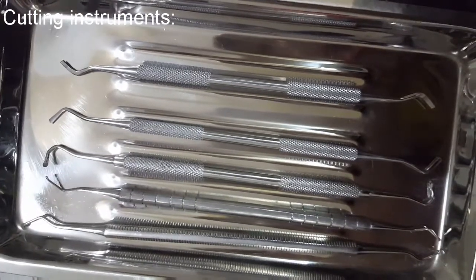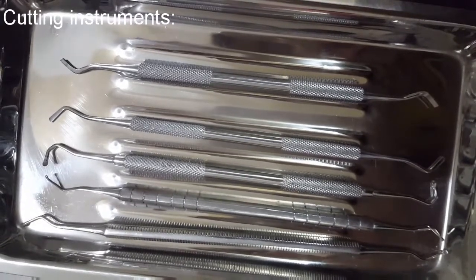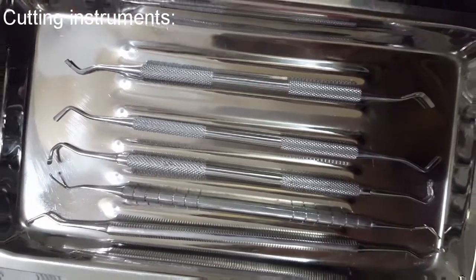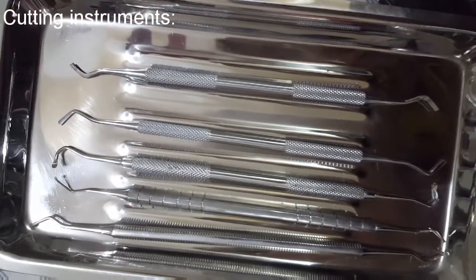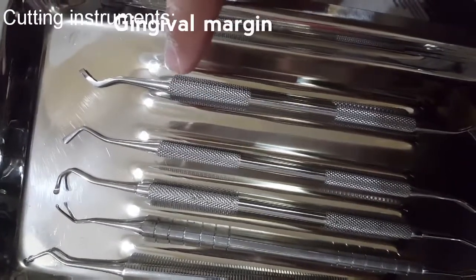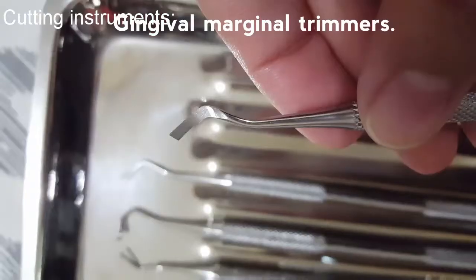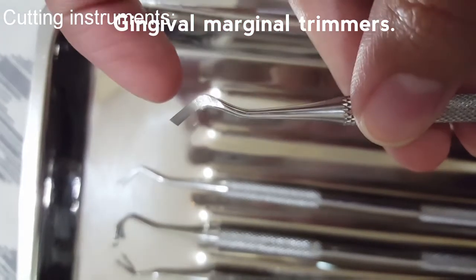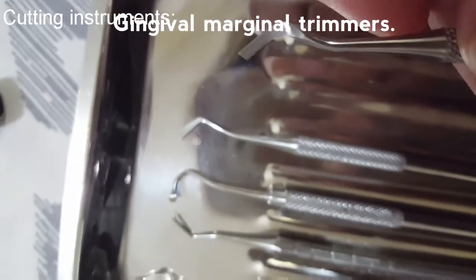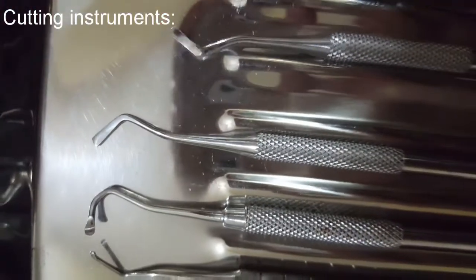Now we have the cutting instruments, which are used to cut the enamel or cut the tooth surface manually when we are being careful not to cut down too much of the tooth surface. So we do it manually instead of using a handpiece, which is much more riskier. So here we have these two gingival marginal trimmers. One is mesial and one is distal. You can tell by the direction of the blade tip, which is in this case pointing upwards. So this is distal, and in this case it's pointing downwards. So that is mesial gingival marginal trimmer.